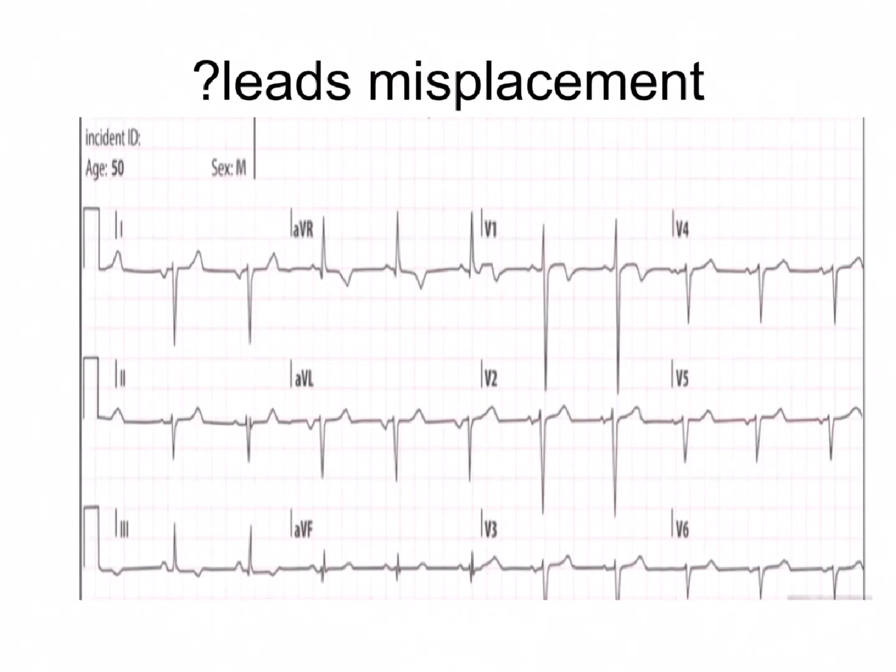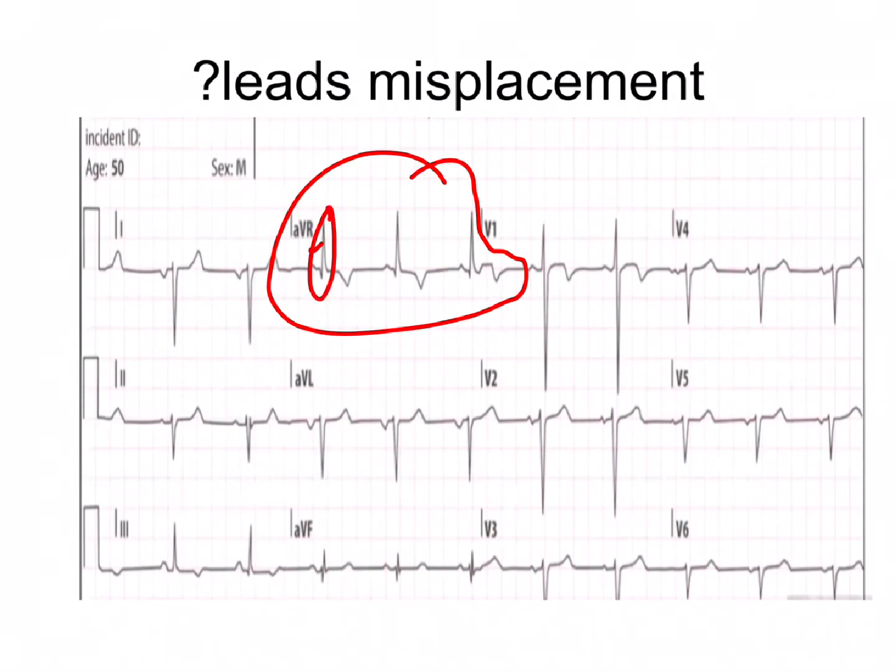Here if we see in this ECG, what we find is that this lead AVR is showing a positive P wave. QRS complexes are also positive. So what should we say? I told that in a normal ECG, in AVR all complexes are negative, but here we find P wave is positive, R wave is there, though T wave is negative.